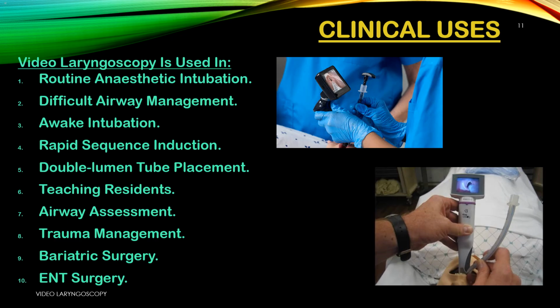3. Awake intubation. Patient stays breathing and conscious. Video feedback helps guide the tube with minimal discomfort. 4. Rapid sequence induction. Emergency intubation where speed matters. Faster first pass success reduces aspiration risk.